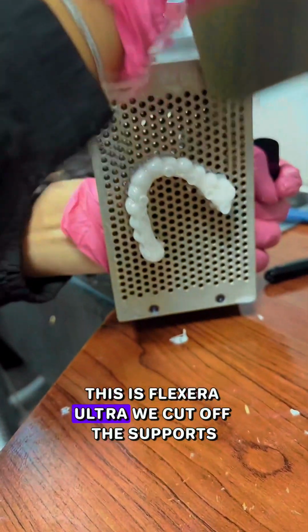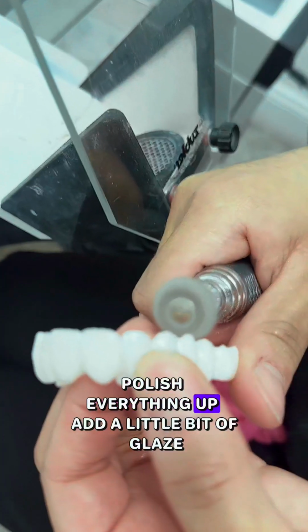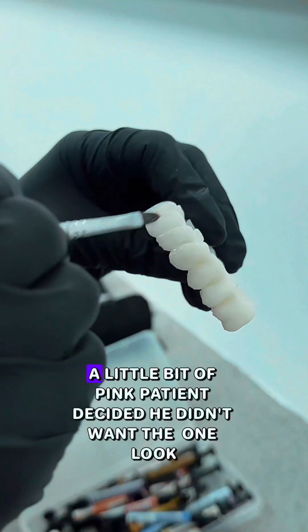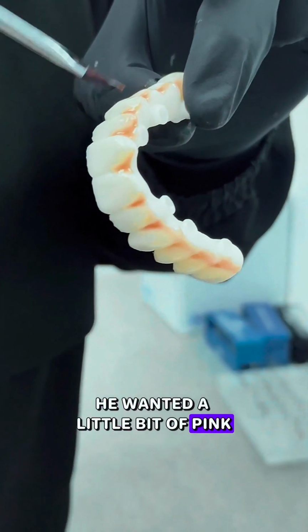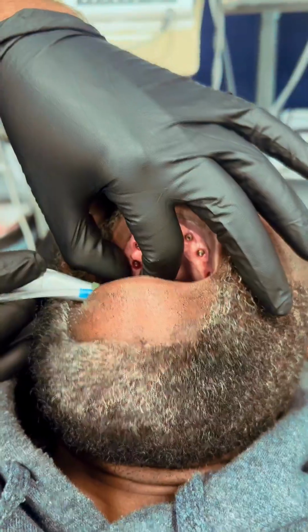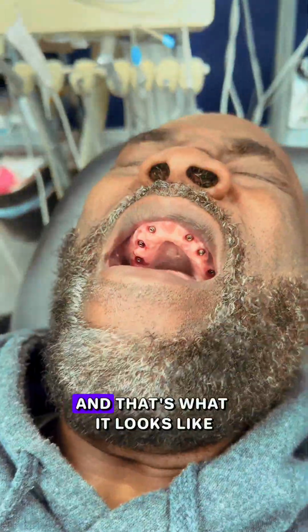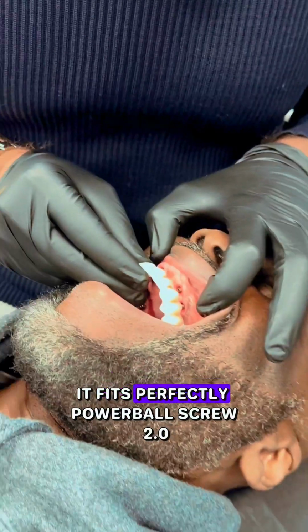This is Flexera Ultra. We cut off the supports, polish everything up, add a little bit of glaze, a little bit of pink. Patient decided he didn't want the FP1 look, he wanted a little bit of pink. Take off the THSs that have been holding the tissue open. And this is what it looks like. And boom, we deliver it. Fits perfectly.